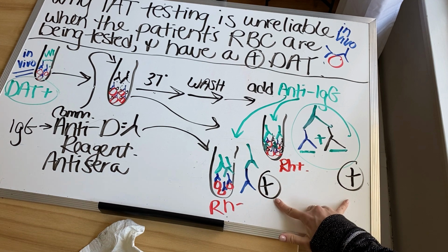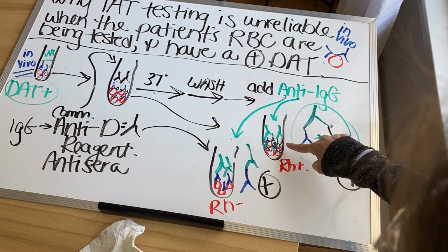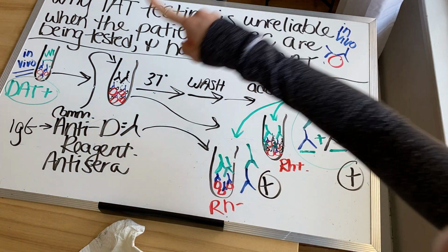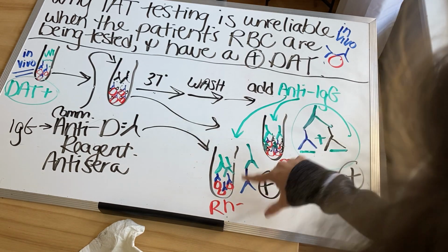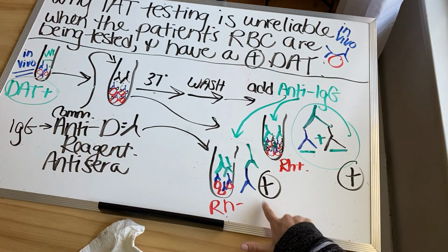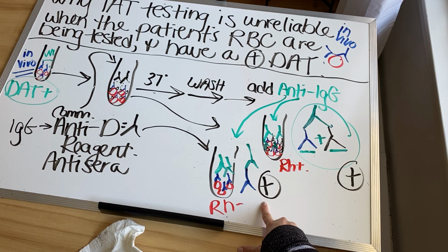They were both positive. When the anti-D truly did bind to the D antigens, we saw a positive result. When the anti-D did not bind to the red cells, to the antigen, and got washed away, we still saw a positive result. This should have been negative.